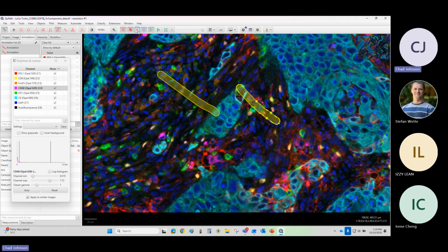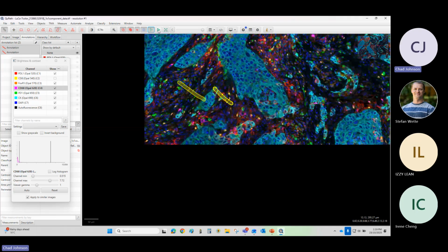The annotation names, if you've named the annotation, this is just called annotation, that will change and show and hide that. We won't be using microarrays. Detection objects: so detected objects, when we start detecting cells, we can show and hide that and make them solid as well.